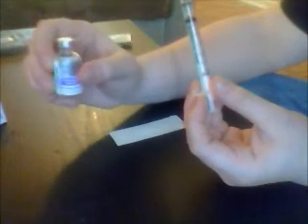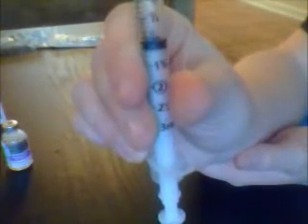So next thing is you're going to be taking something out of the testosterone bottle, so you want to replace what you're taking out with air. So I start at the bottom here, and then I'm going to pull it back until there's 1 cc. I don't know how well you can see that, but there's 1 cc of air. And then the next thing you're going to do is make sure there's nothing around you, because the first like 3 times that I did this, I knocked things over. So you want to take the cap off. Sometimes it's hard to pull off, sometimes it's not. Just set it aside.